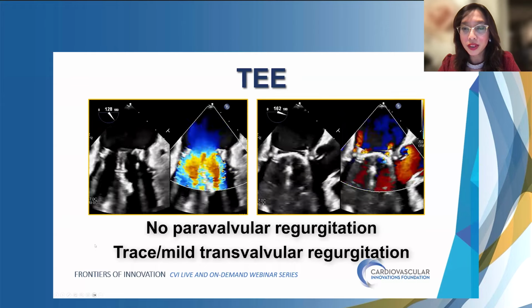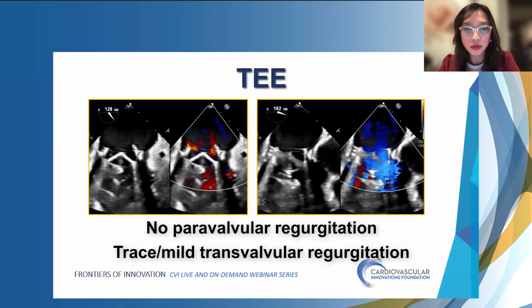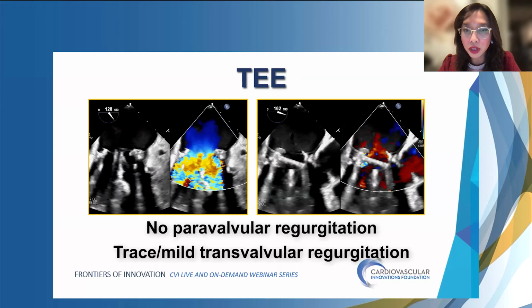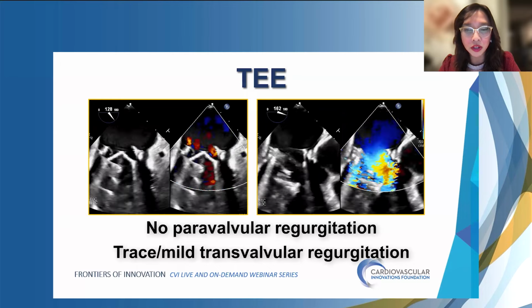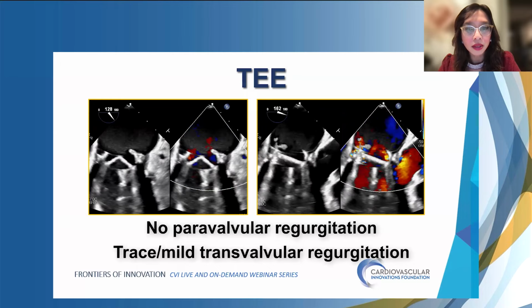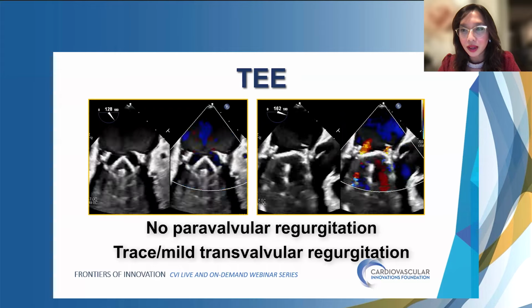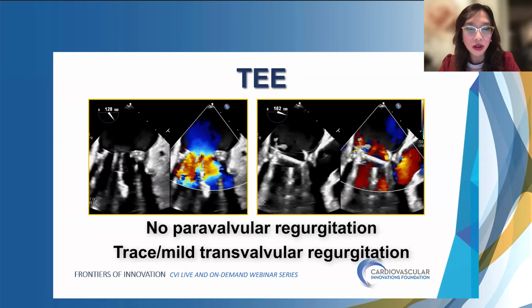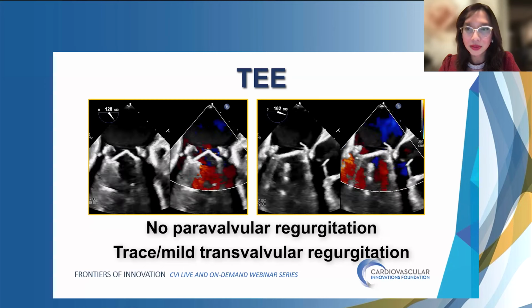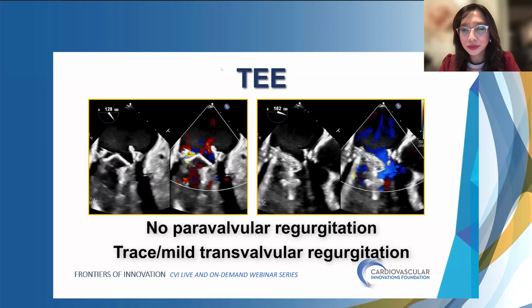In terms of whether he has regurgitation due to this, there wasn't much paravalvular leak, just trace to mild transvalvular leak physiologically. And it's just these new findings. So, Abdullah and Sanjam, what are your thoughts, and what would you do as the next steps?